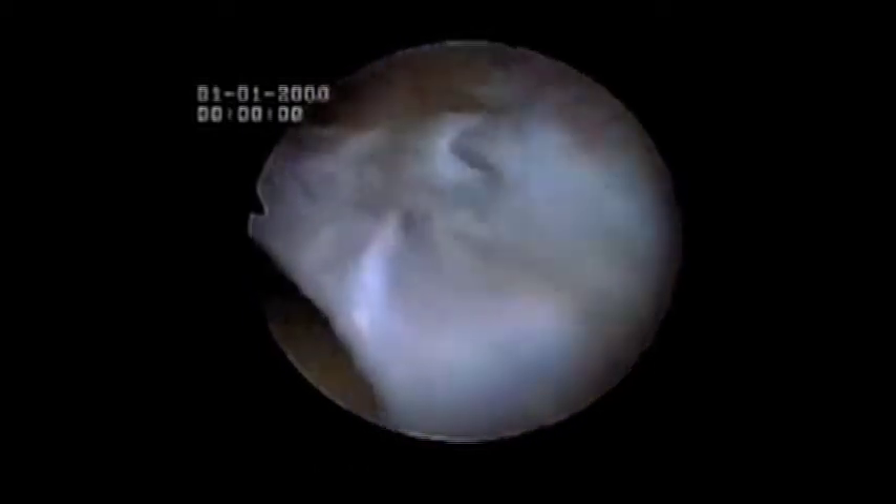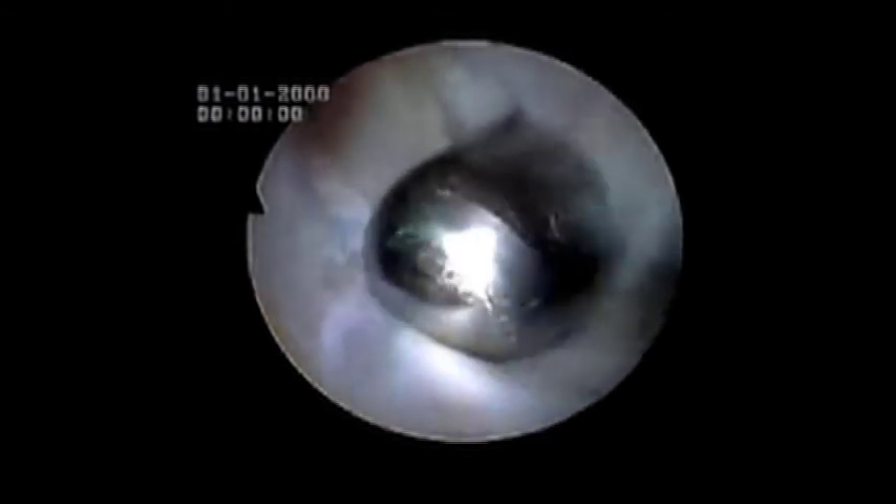All in all, in depth this band is some 8-9mm, stretching throughout the whole anterolateral compartment of the ankle joint. Removing this frees up the ankle joint and almost overnight allows the patient's preoperative pain, snapping, and clicking to be resolved.